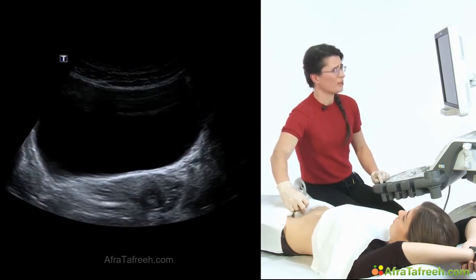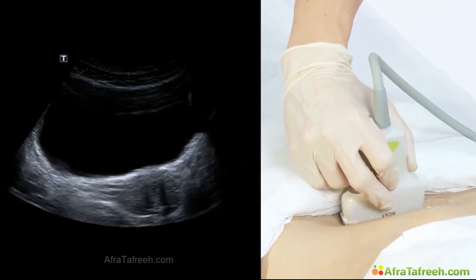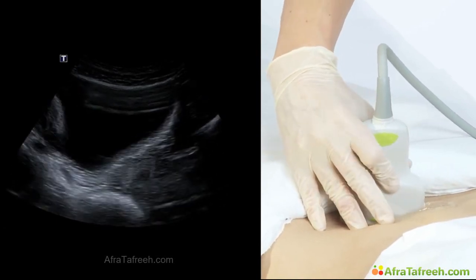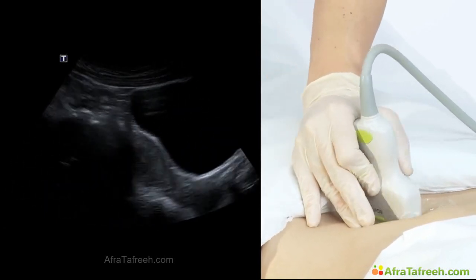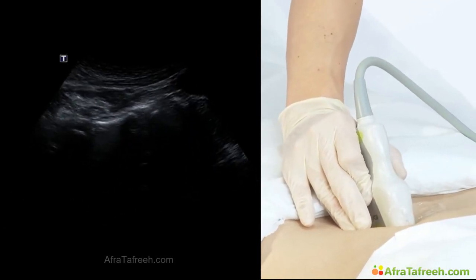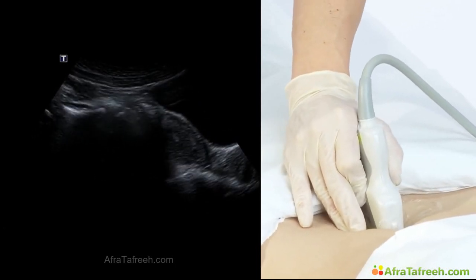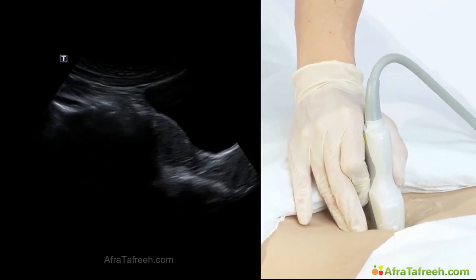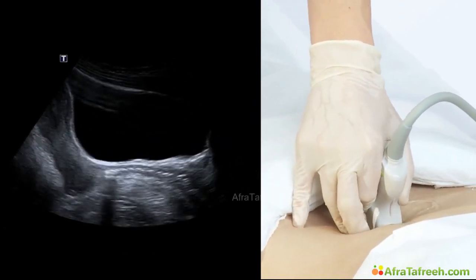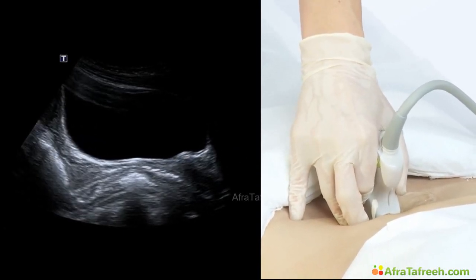So we turn our transducer clockwise in a sagittal position. It's easier to keep one finger at the body of the patient and now slowly turn until this mark of the transducer is pointing to the patient's head, as you can see here. So that we get a good view of the urinary bladder. You see it's not so easy to get. You have to tilt really behind the pubic bone. So now we got a sagittal scan of the urinary bladder.